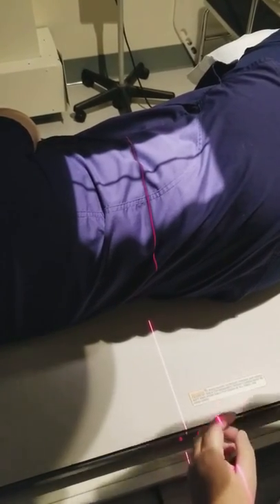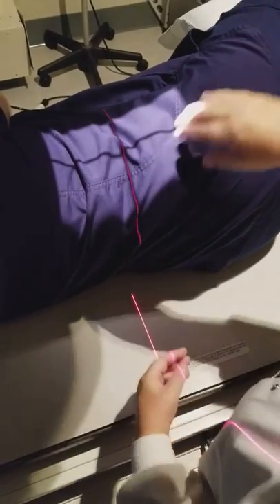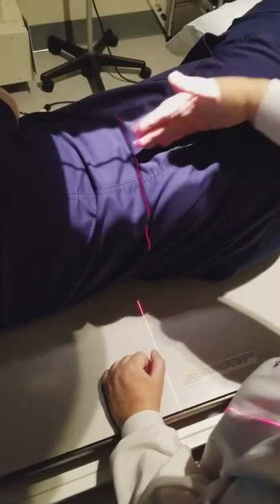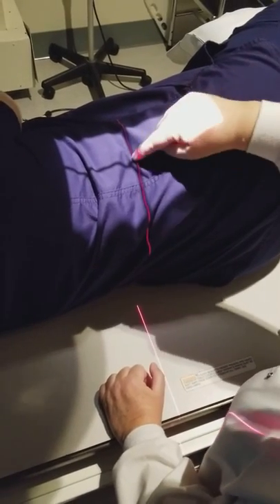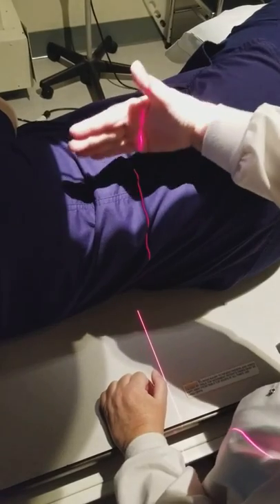Oh, my collimation — I pulled the bucky out so the collimation isn't correct, let me fix that. Okay, 8 inches wide, 14 inches long. The central ray along the long axis is centered at the highest part of the crest, which is directly over the spine.